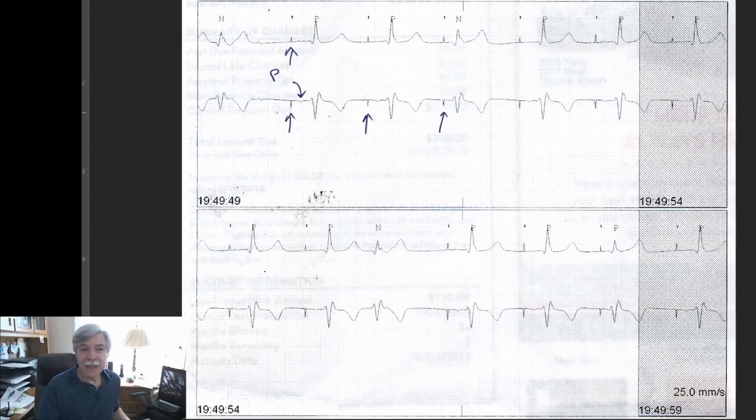But basically, what I see is an atrial pacing spike, and it's followed by a P wave, and then there's a QRS complex, but there's no spike in front of the QRS. And so it would appear that these QRS complexes are conducted, because after all, when you pace in the atrium, you get a P wave. If the AV node is intact, that QRS complex will be inscribed by the conduction system.